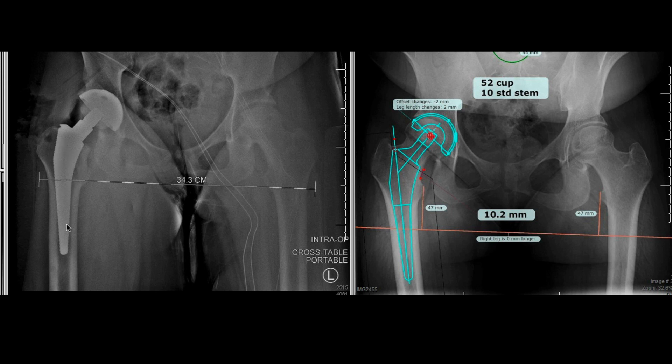I then also want to look at the fit: Is this the right stem? Is it in varus or valgus, or is it well aligned? And how good is our fit and fill proximally? What is very helpful at this point is that if anything needs to be changed, I can make that adjustment. If the stem is undersized or in varus, we can go up on the stem size. If I need to change the abduction angle or anteversion of the cup, that can also be accomplished. We can also change the stem offset, the liner offset, or the head offset if needed.